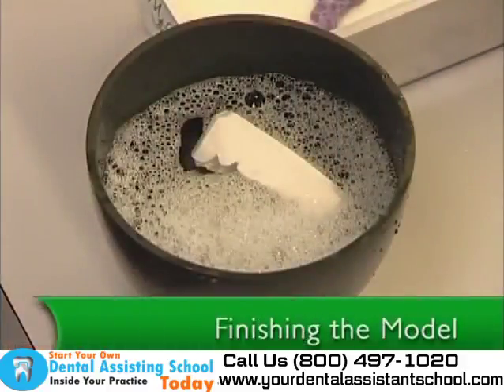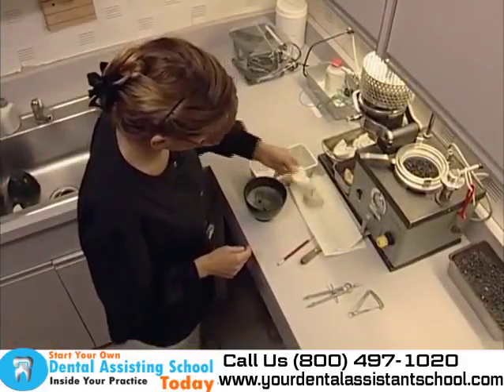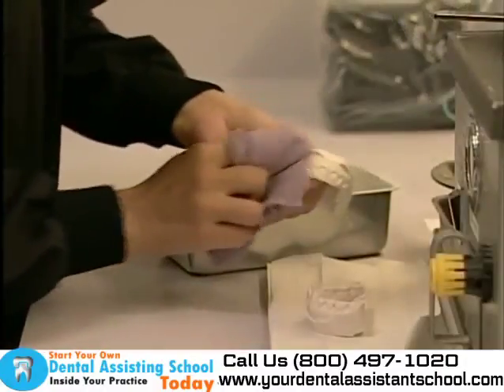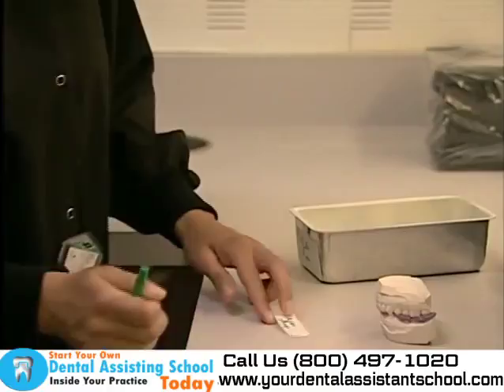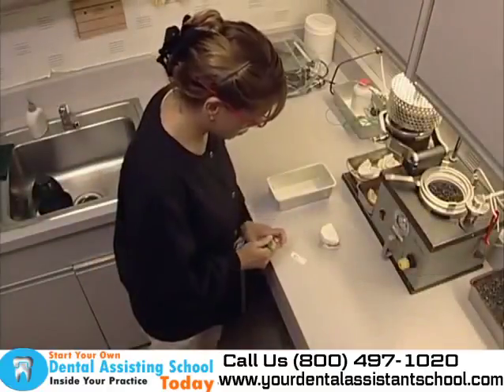For a smooth overall appearance, the dental assistant needs to finish the model. The model is soaked in soapy water for 24 hours, allowed to dry, and then buffed to a high gloss with a soft cloth. When complete, the assistant writes the patient's name and date on the model with a model marker or on a stick-on label.